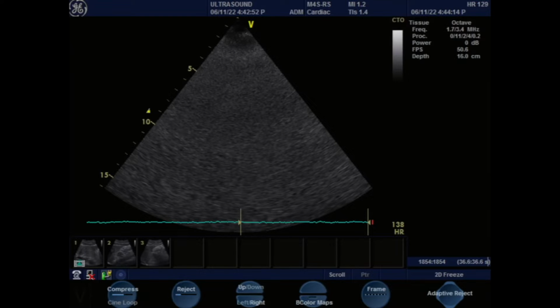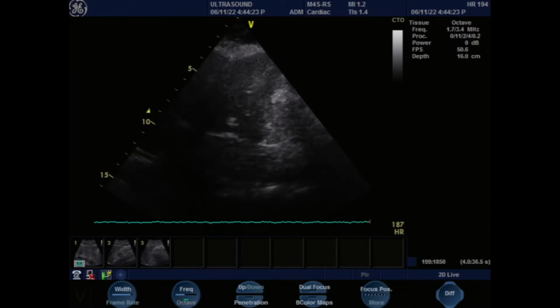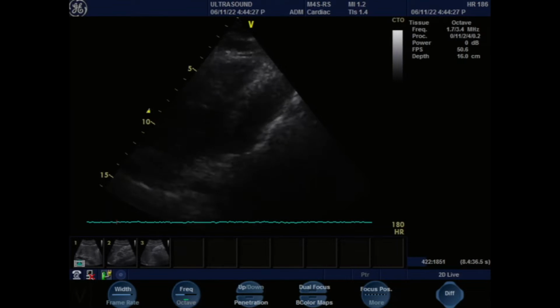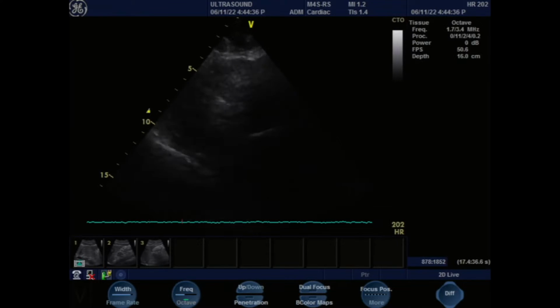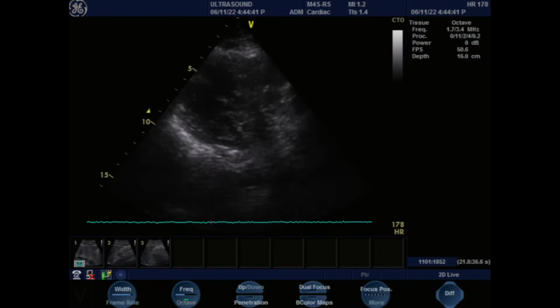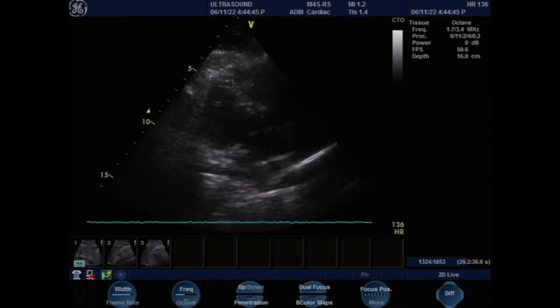So what we're going to do right now, just put some cold jelly here, just going to get an idea of what we're dealing with heart-wise. Okay. So here, what I'm trying to do is get an idea where the heart is here, to see what we're dealing with. Burhan, can you mention the axis that you're on? Yes. First of all, I'm just going to get an orientation to get an idea of where I'm at. So this is what we call a parasternal long axis view.